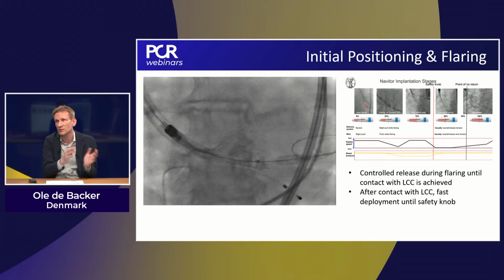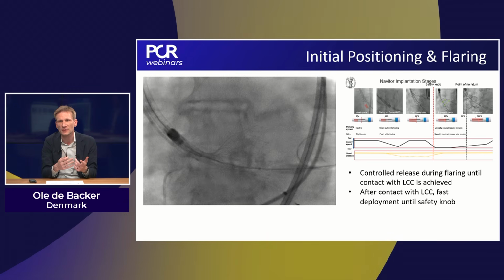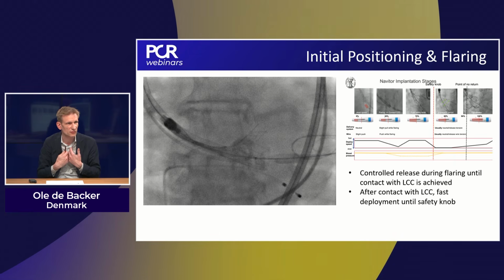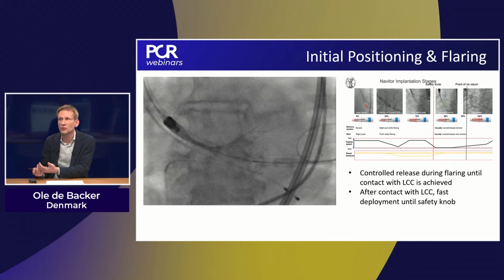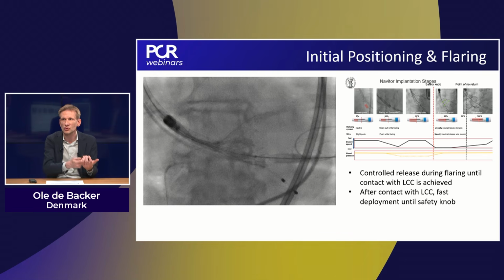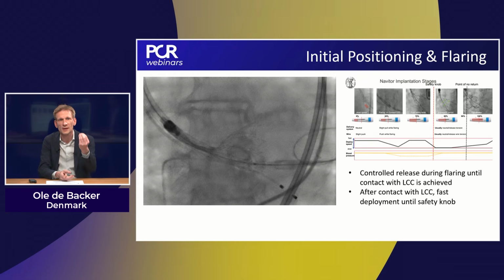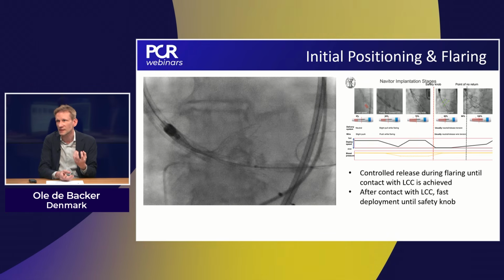Typically it's more center or outer, but that's extremely important information if you would go to cusp overlap. If I use a Navitor 35, I don't even go to my cusp overlap, I go tricuspid, and I correct for my parallax typically because it's so essential, like in this case, to know where that prosthesis is, so I get out of that cusp overlap.